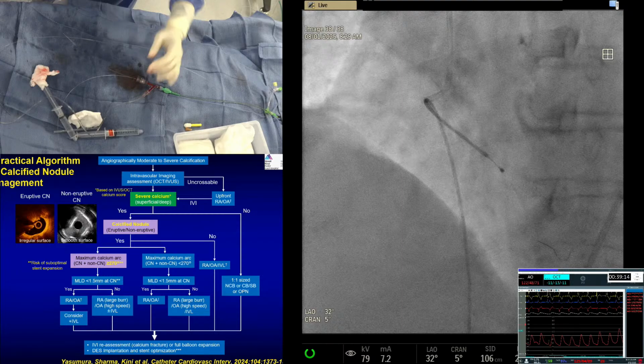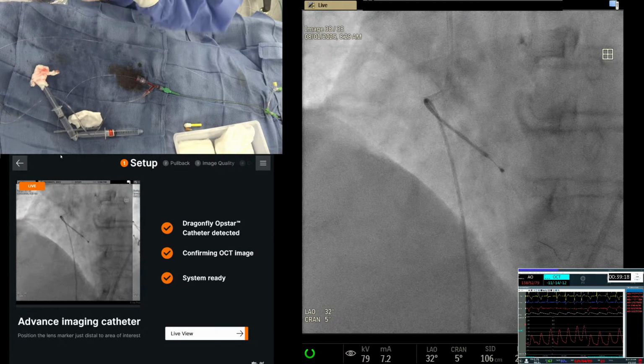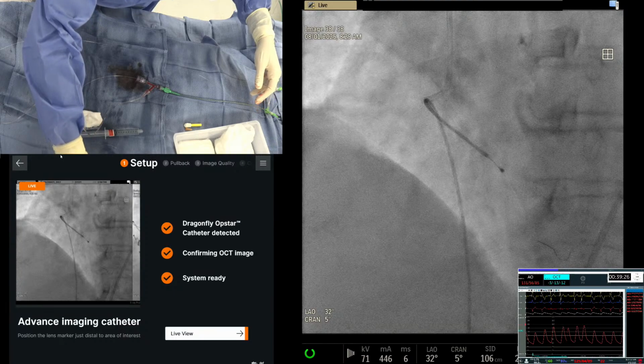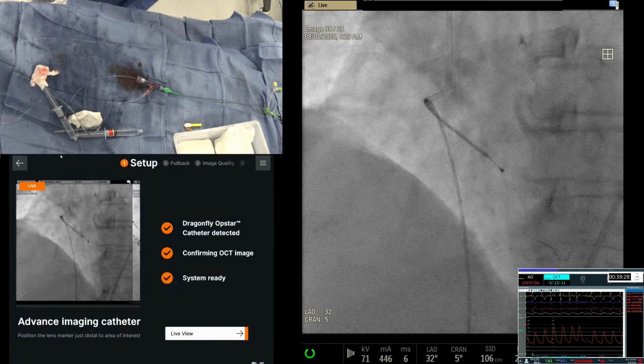No, don't put it like that. Go back, stop, start from the beginning. Go to the slide from the beginning, because I want to show step by step.